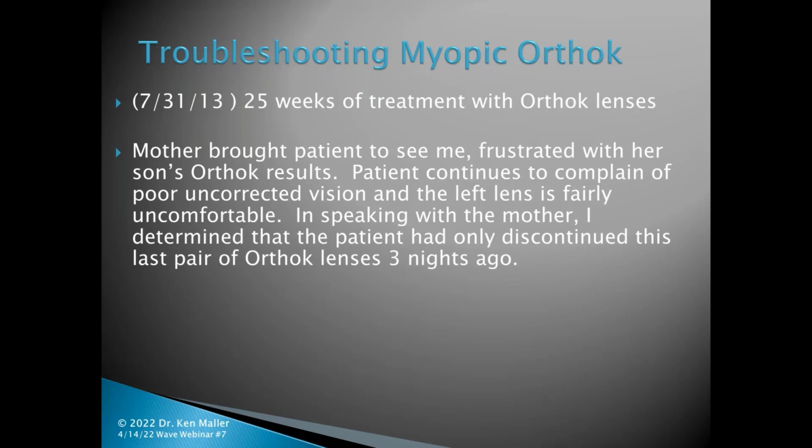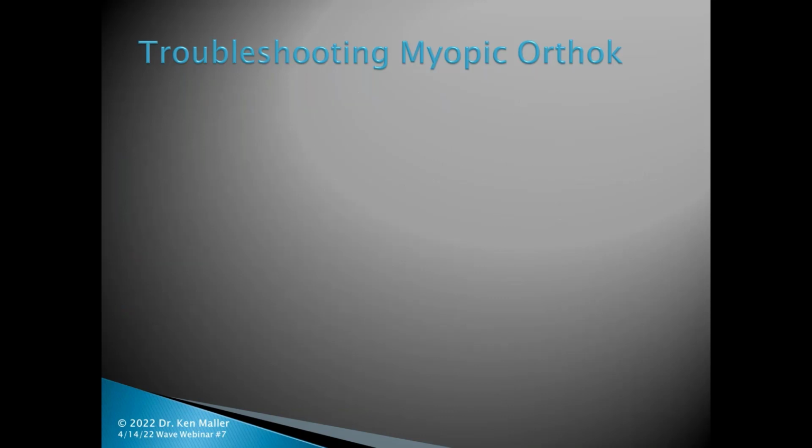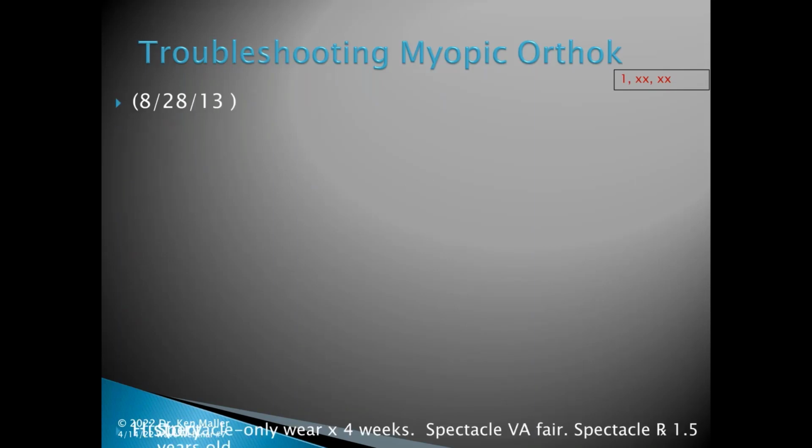In speaking with the mother, I determined that the patient only discontinued this last pair of Ortho-K lenses 3 nights ago out of frustration. And so I explained to the mother that I really wanted him out of the lenses for at least another 3 weeks before addressing him with Ortho-K, because I really wanted to get good virgin topographies on him. He was to wear his spectacles in the interim. First visit with me for treatment was at the end of August.